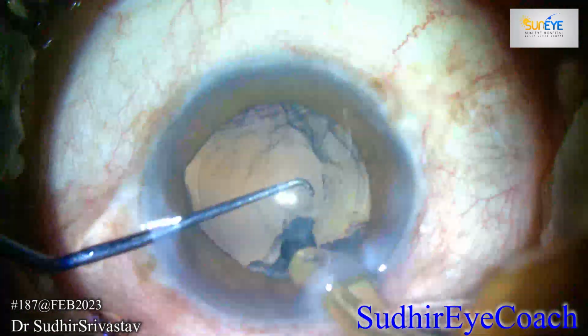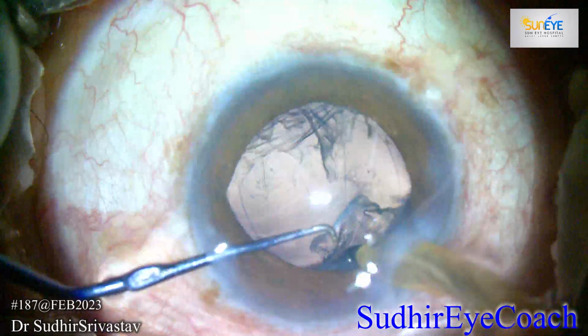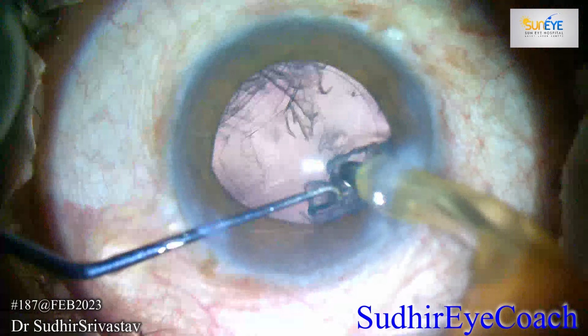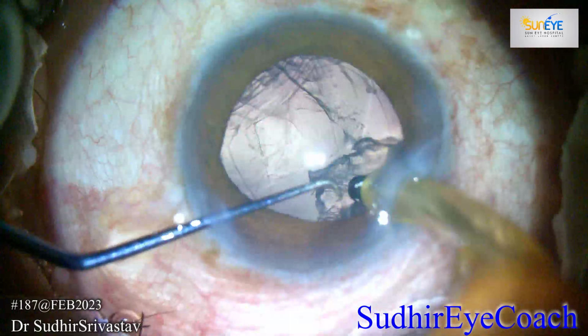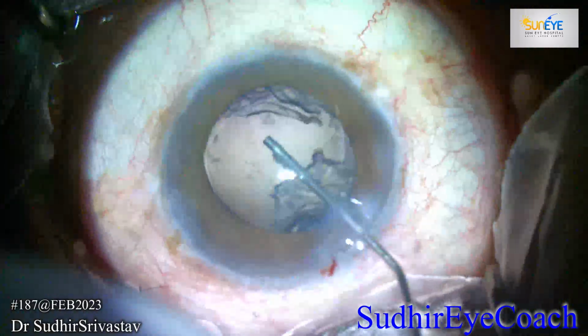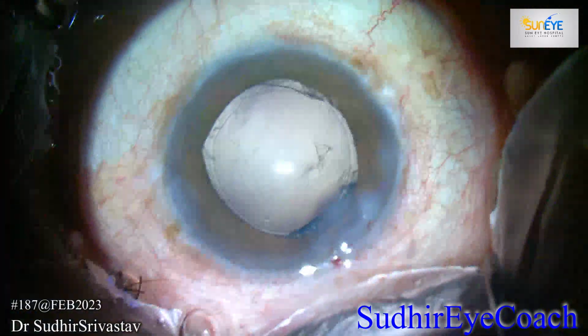I am an old generation phaco surgeon and more comfortable with the coaxial IA. Removing cortex from the subincisional area is always tricky with the coaxial. I made reasonable efforts to remove whatever cortex I could. Then I filled the chamber again with the viscoelastic.